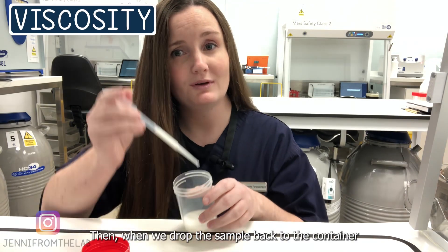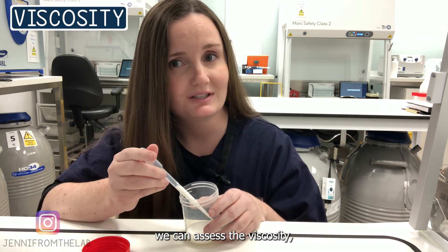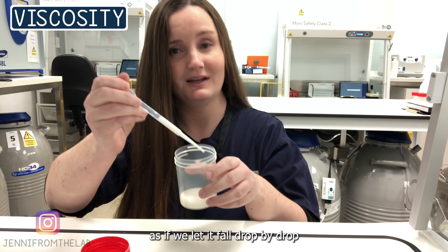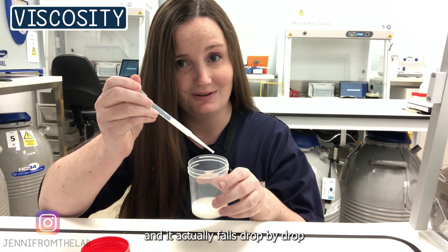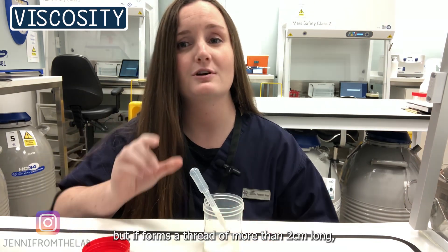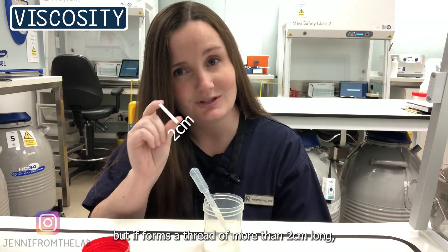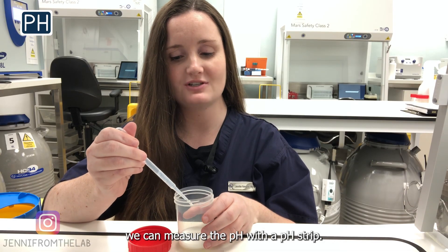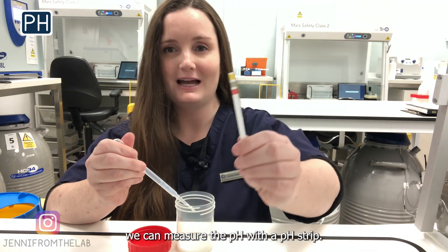When we drop the sample back into the container, we can assess the viscosity. If we let it fall drop by drop and it does fall drop by drop, the viscosity is normal. But if it forms a thread of more than two centimeters long, the viscosity is abnormal.